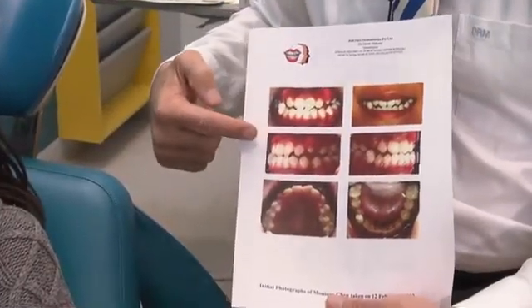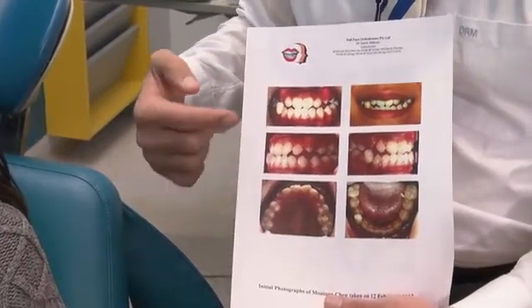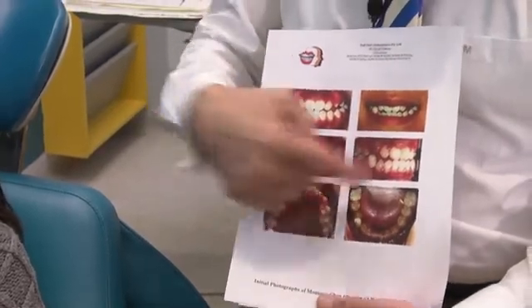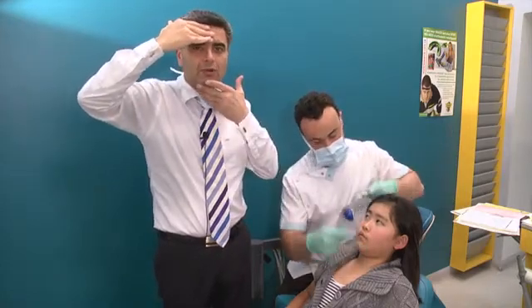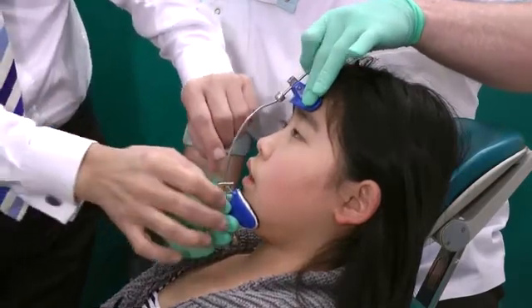Looking at where we started, you can see the negative overjet. You could also see that we have quite a constriction of the upper arch relative to the large lower. Looking now — you can see we've actually gone to Class 2, and that's very good, efficient face mask therapy. So we're fitting the reversible face mask. The first thing we do is make the forehead strap and the chin strap comfortable.